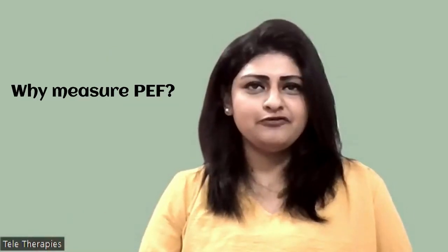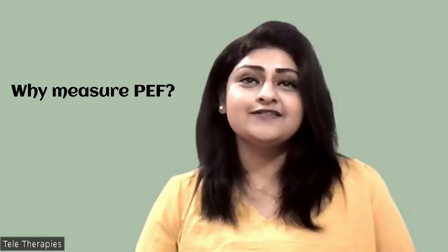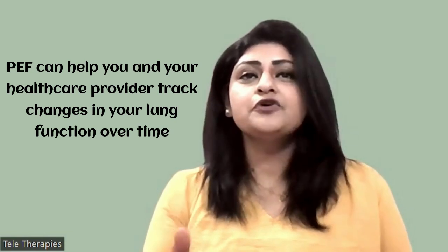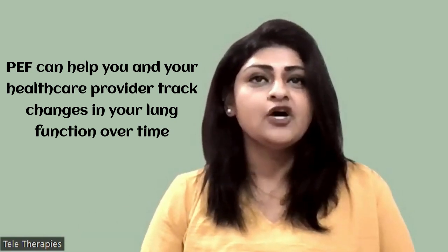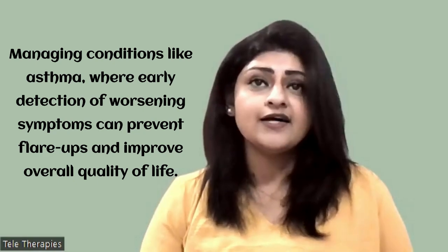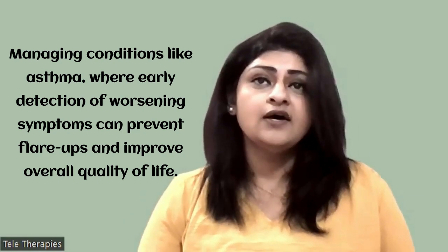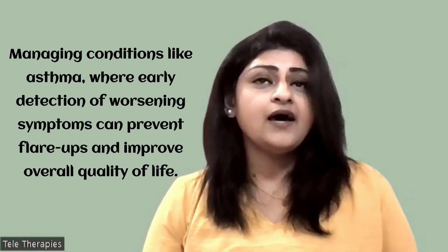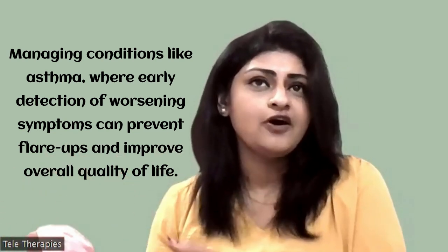Why measure peak expiratory flow? Good question. Monitoring peak expiratory flow can help you and your healthcare provider track changes in your lung function over time. It is very important in conditions like asthma to manage symptoms and tailor the treatment protocol according to changes in lung function. And in that way, you also improve your quality of life.